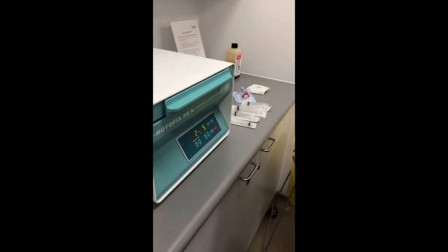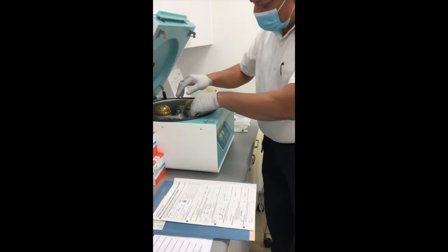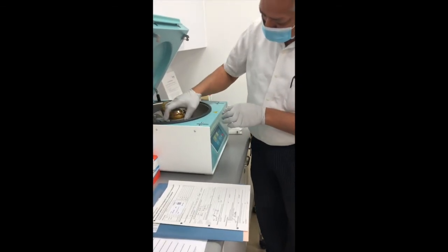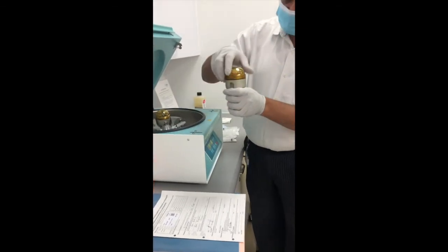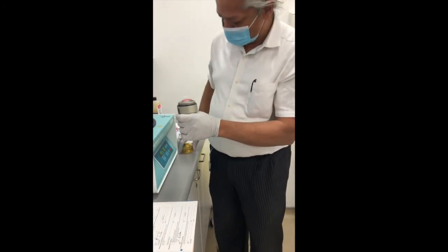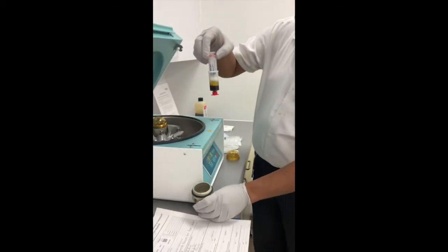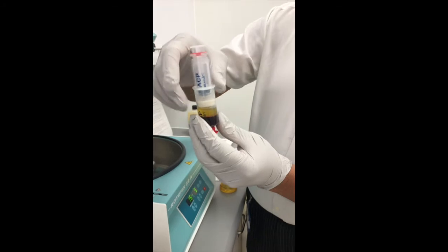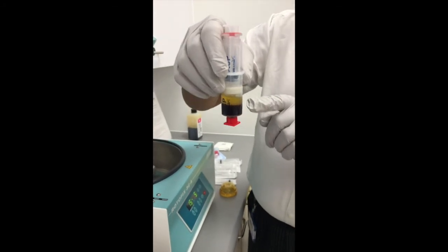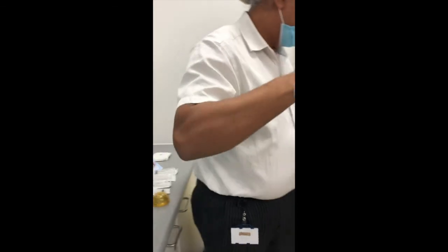The centrifuge runs at the recommended speed and time, which may differ according to the manufacturer. Here we have our sample after centrifuging, showing separation of the blood components — cells at the bottom and plasma at the top. It's quite important to keep it steady, otherwise the layers could mix.